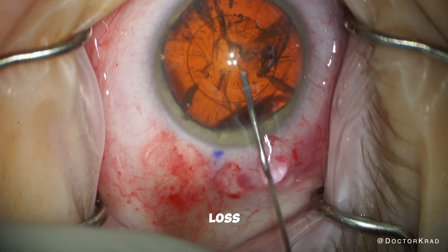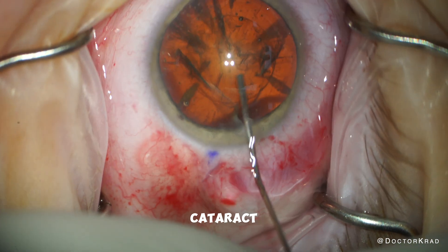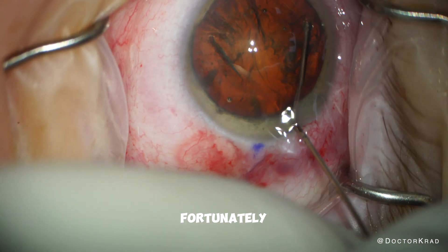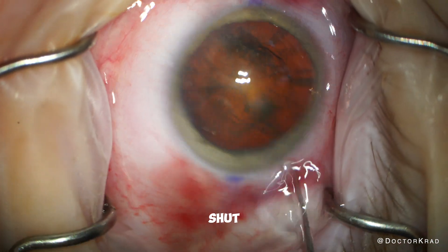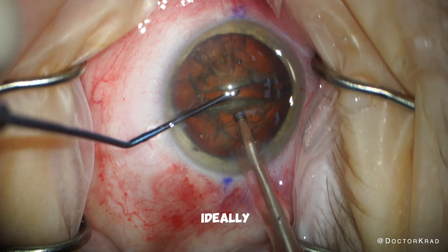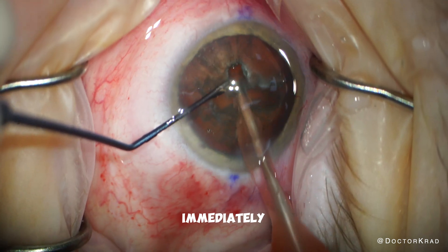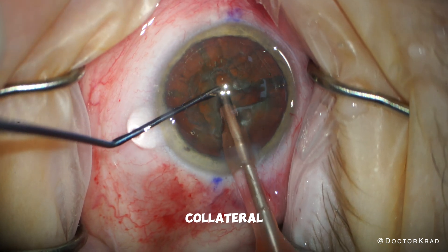So the suction loss issue is a disadvantage of laser that you don't have with manual cataract surgery. Fortunately, it's not a very common issue, and lasers are smart enough to automatically shut off if there's an abnormality detected, such as suction loss. Ideally, the laser should stop firing immediately so that there are no stray shots and no collateral damage.